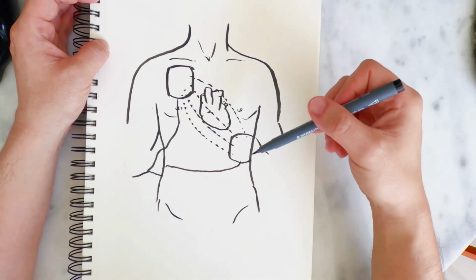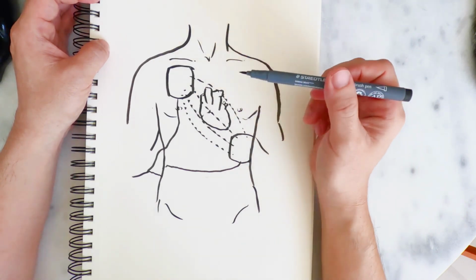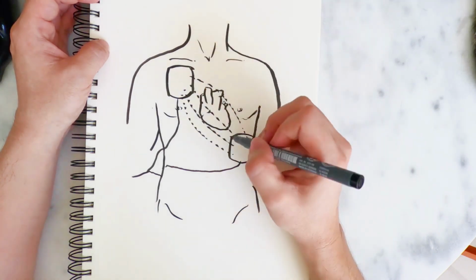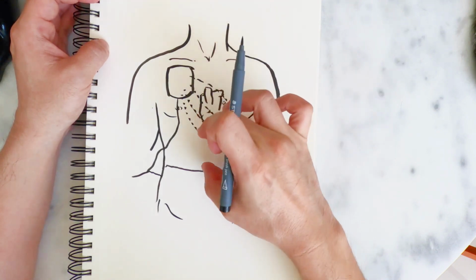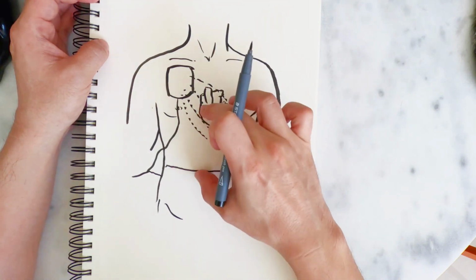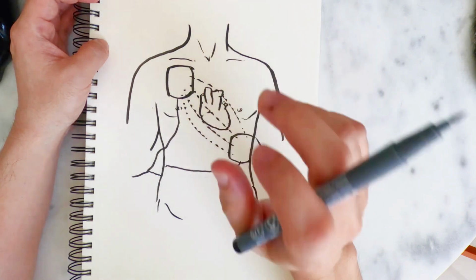However, in the first image, which shows the pads being placed on the abdomen instead, you can see that the direction does not pass through the heart, but rather through the intestines. Therefore, the electrical shock was unsuccessful. This is basic knowledge that rescuers need to understand. Those who assist patients must realize that the pads need to be placed in this direction.